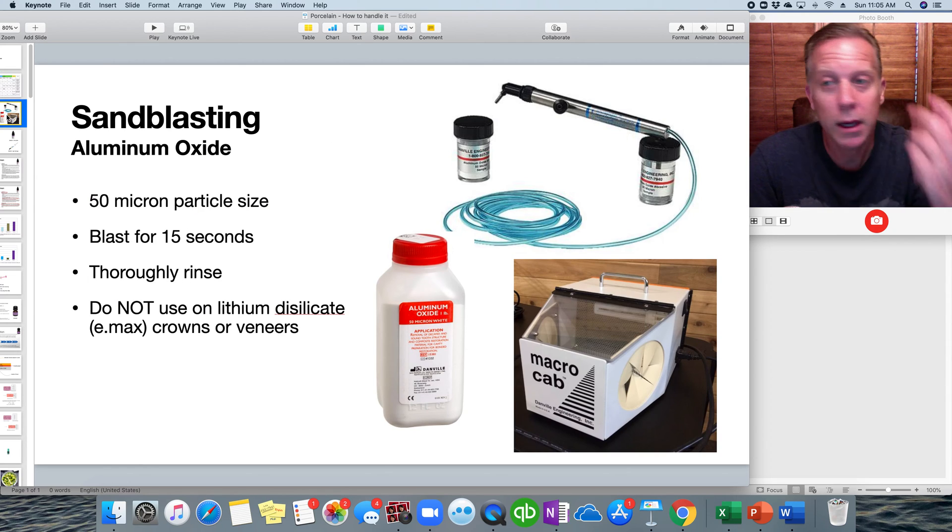Starting with sandblasting: the medium we use is aluminum oxide, which comes in 27 to 50 micron sizes. 50 micron seems to work just fine and is the most popular. We blast the internal of a restoration for 15 seconds with the Danville Engineering sandblaster — pretty much everyone has this in their office. The Macro Cab setup shown keeps the sand from making a mess. After sandblasting for 15 seconds, thoroughly rinse — either in an ultrasonic bath or with air-water spray — making sure to get all granules out before continuing.